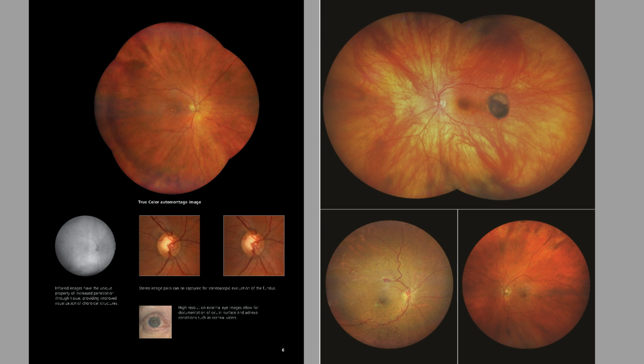So that's very important for those overseas optometrists that can't use diagnostic drugs as yet, that this instrument will work even though the eye is not dilated. That's very important information. Absolutely. No one makes a fuss over that, but it's important. I think it's important even here in the U.S. Dilation, for whatever reason, isn't routinely done in many places. Sometimes you can't, and so having an instrument that works well not dilated is major competition to the ones that advertise that you don't need dilation.